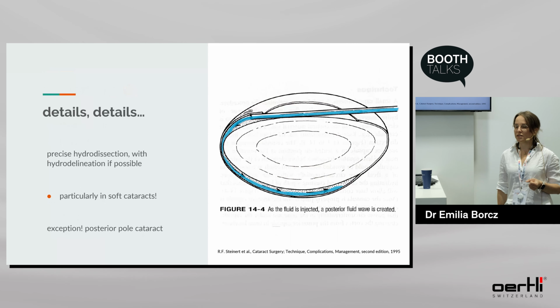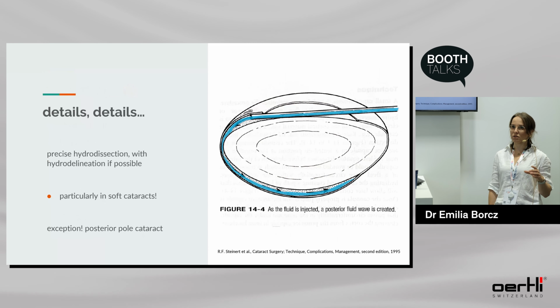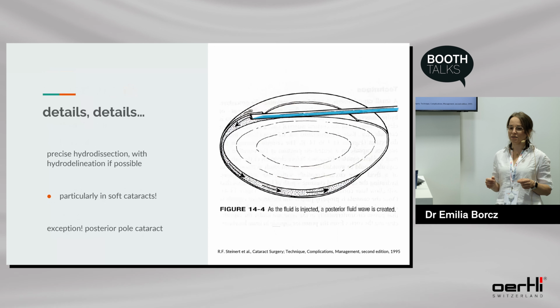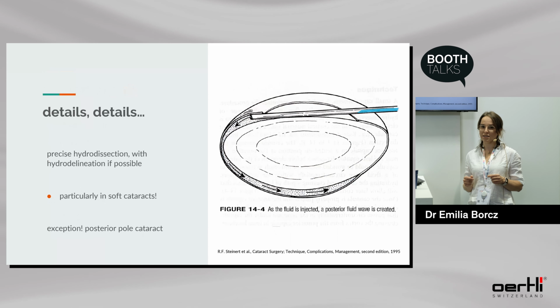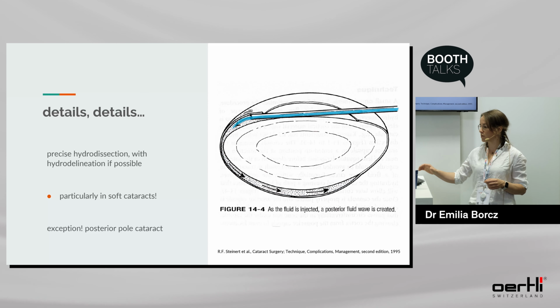In phacosurgery, the details are the most important, and I think that hydrodissection is the most important step of the surgery. When I was learning surgery, everyone told me that capsulorhexis is the most difficult one, but I think that precise hydrodissection is even more difficult. Of course, I try to perform hydrodelineation, particularly in soft cataracts, but precise hydrodissection is very, very important. And the exception is, of course, posterior pole cataract.